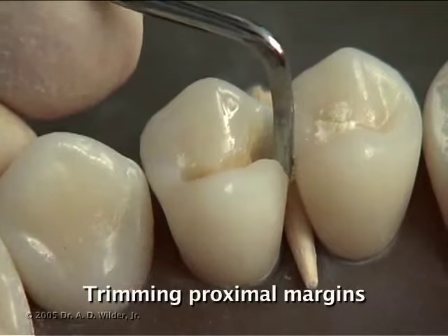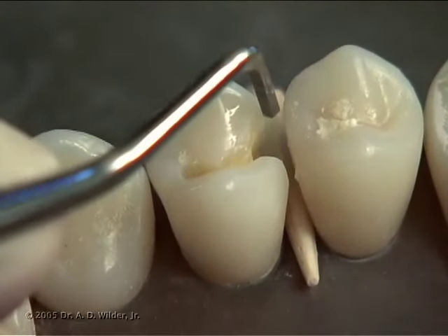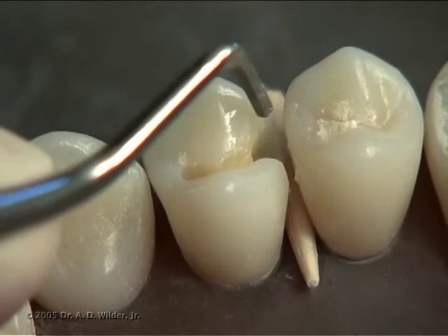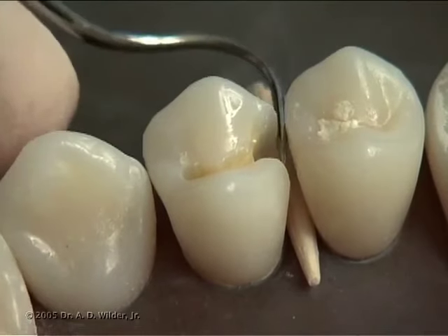Due to the round shape of the burr, it's very likely that you'll leave hooks or spurs of enamel at the corners of the proximal box, so you can use an enamel hatchet to trim these margins and remove unsupported enamel.